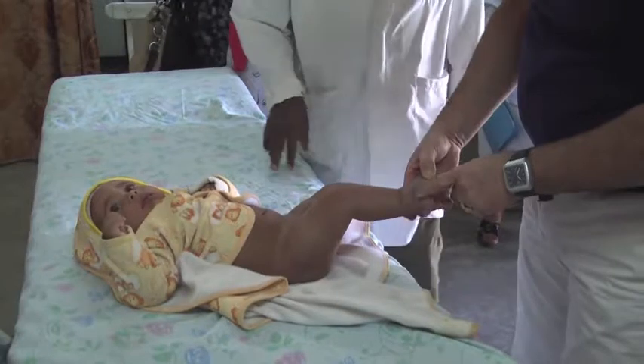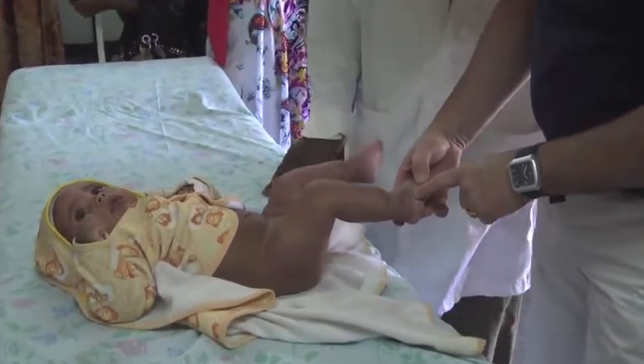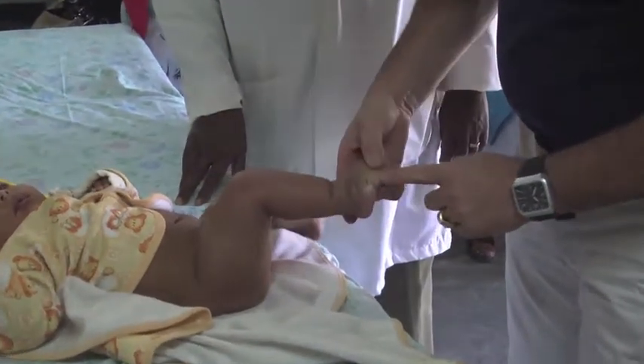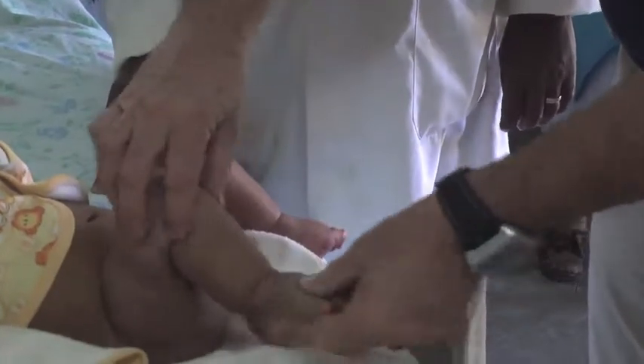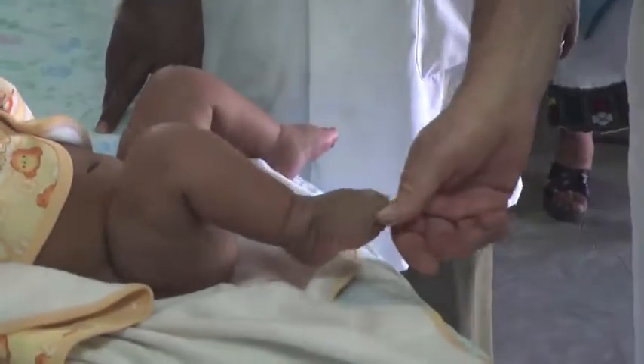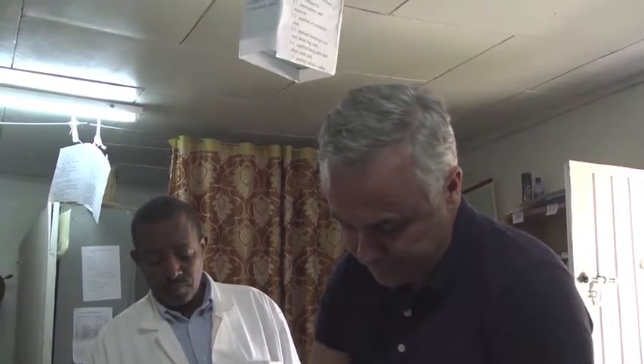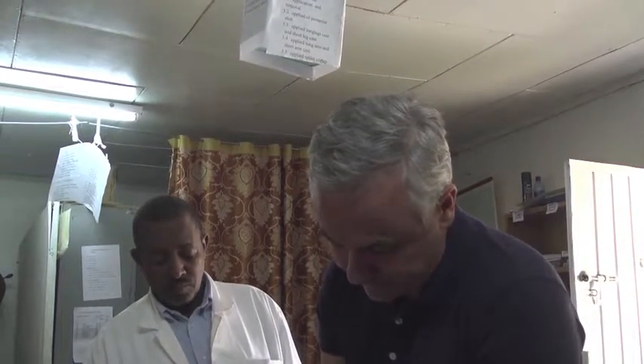The problem here is the skin which is folding like that with the Ponseti. So this is a follow-up patient — the patient's already had six weeks of Ponseti plaster casting. This is bilateral, and the result is very good. You see the folding of the skin here, which is very typical in these situations.